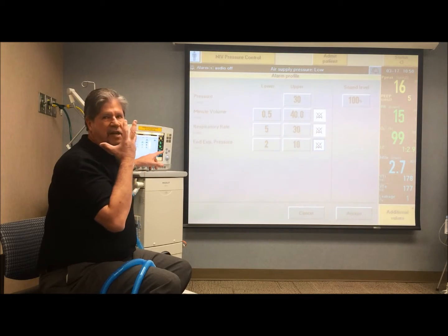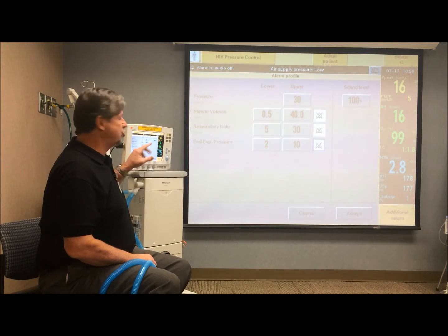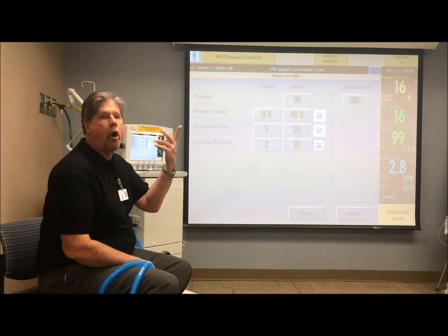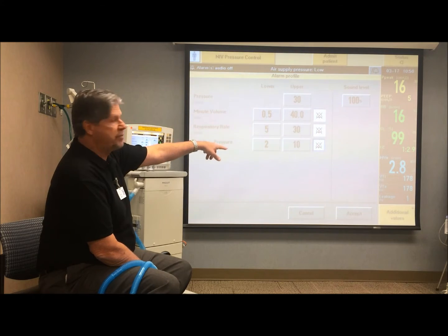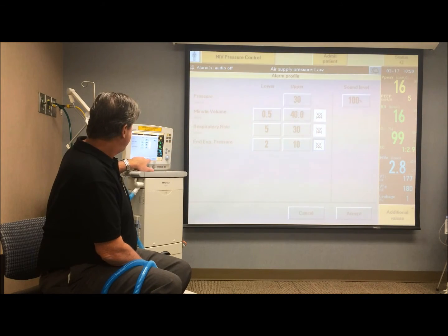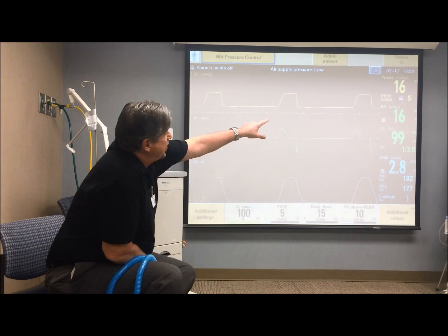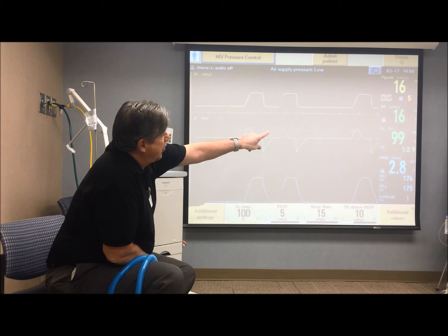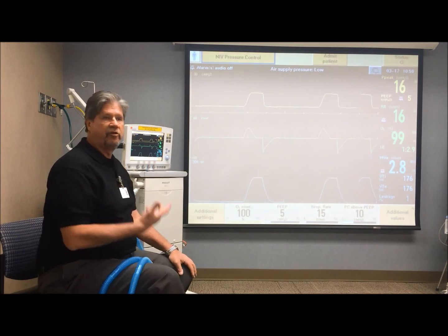His wife is there and it's going to fix it. At least you have a visual indicator, because these alarms will visually flash, but it won't alarm when you turn the bells off. And it tells you on the side of the ventilator: you see the PEEP over there, there's a little bell with an X through it, and the respiratory rate, a bell with an X through it, and the minute volume, a bell with an X through it, so you know that somebody's turned those alarms off.